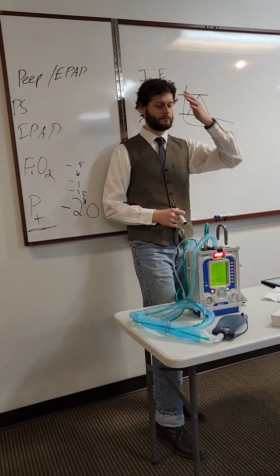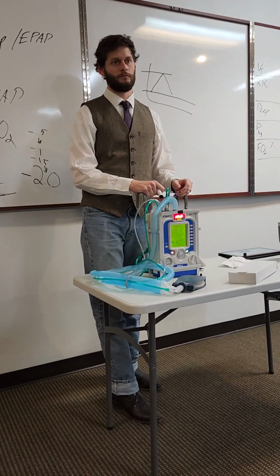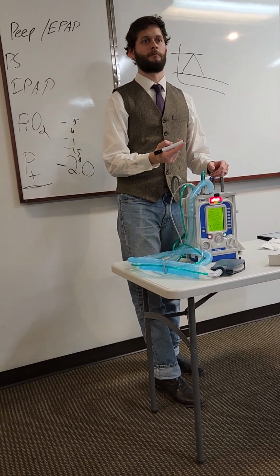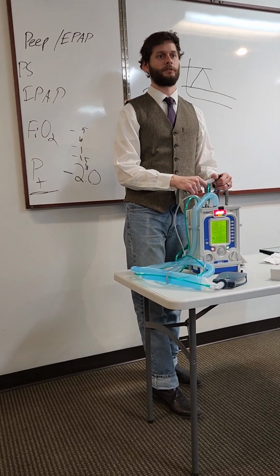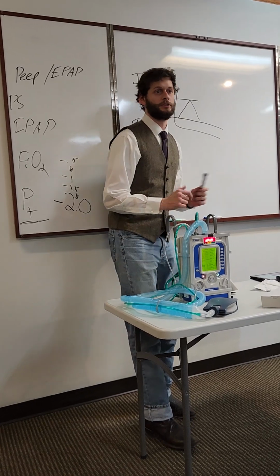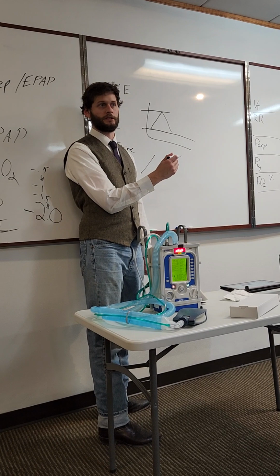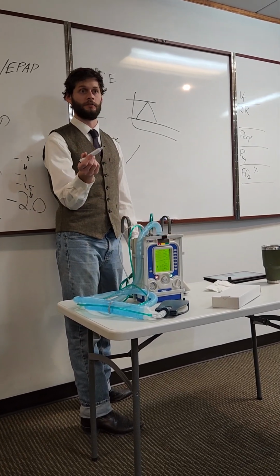And this thing, its default setting is to operate from pressure settings. Because you said this thing is pressure regulated. Yep. So that's more about your triggers, right? Your triggers, and it's also going to give you the PIP. So it's always following the PIP. If your PIP gets too high, it's going to cut the breath. It's going to say airway pressure is too high, we're not giving any more than this because it's higher than you set it to be.